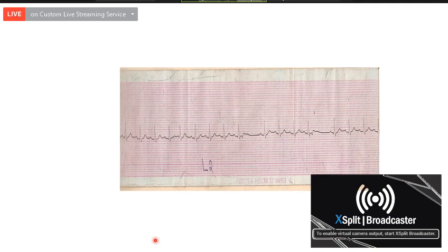You can see two negative waves here. One is here and one is here. What do you think that wave is? Is it a P wave? If it is a P wave, ectopic. Yeah, it's a low atrial, it's an ectopic P wave. And what has happened here? Compensatory pause. Yeah, there's a pause.